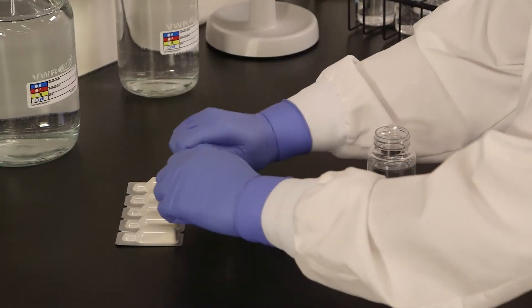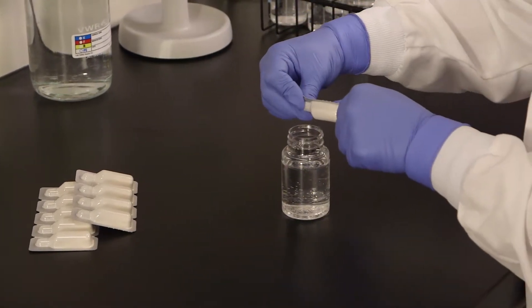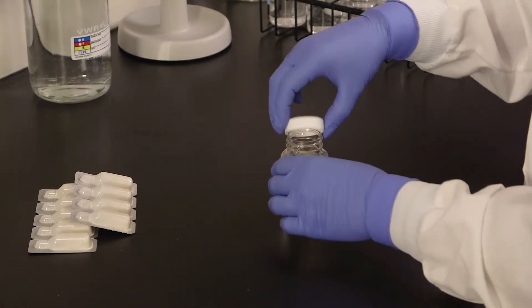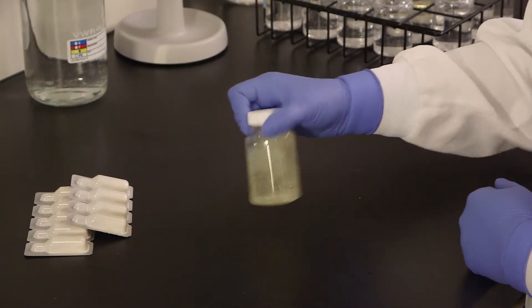Separate one reagent pack from its strip, taking care not to accidentally open the other packs. Snap open the reagent pack and pour the powder into a 100 milliliter water sample. Cap the vessel and shake to dissolve the Entralert powder. Some particles may remain undissolved.